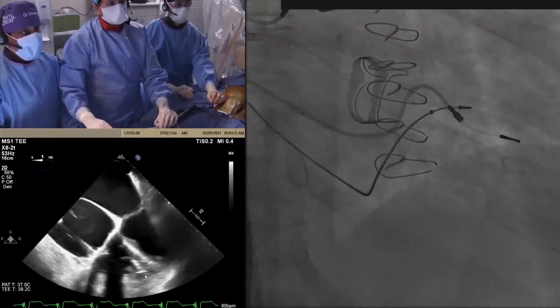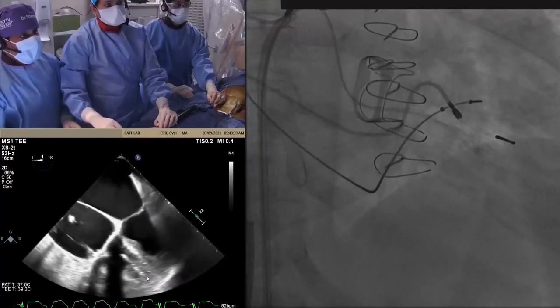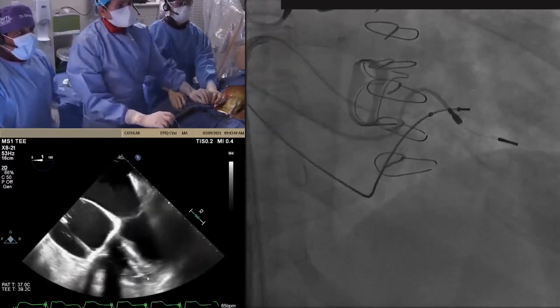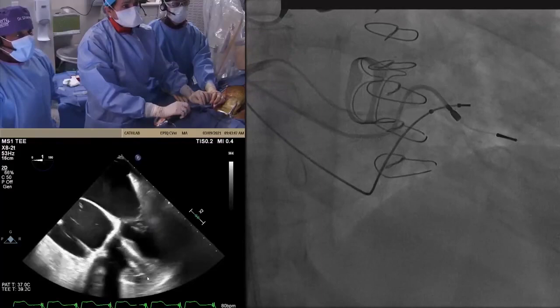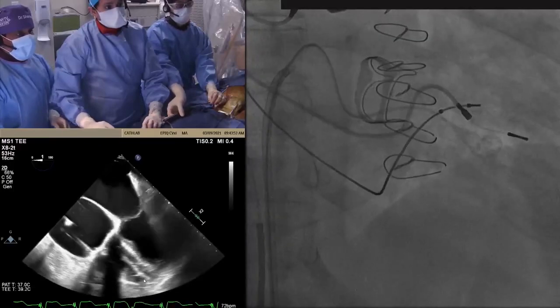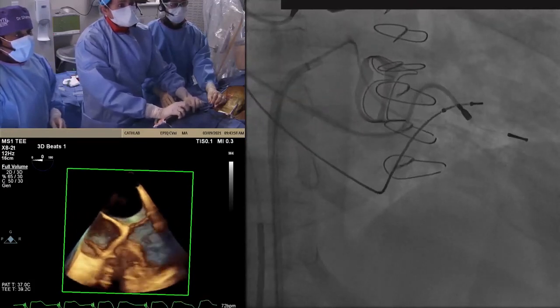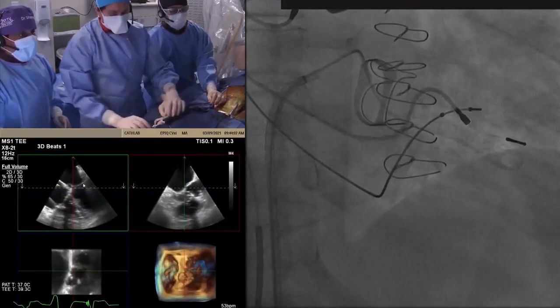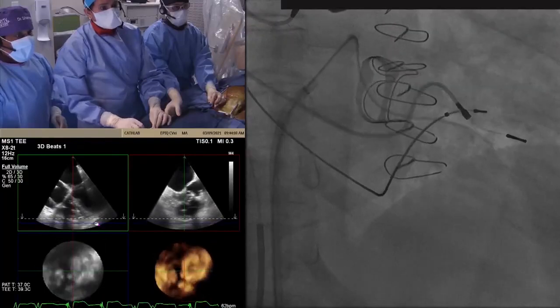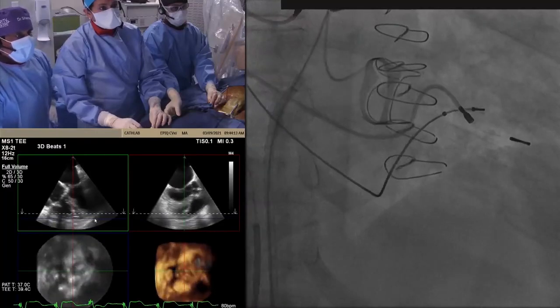It takes away a little of the left RA. Now, how do we take away that loop of the RA? Still pull, right? Pull back. Pull. Like that. Nice. Wow, it's a trabeculated RV. Is the pigtail stuck in something? Maybe pull on the pigtail a little bit. Before you lose it.